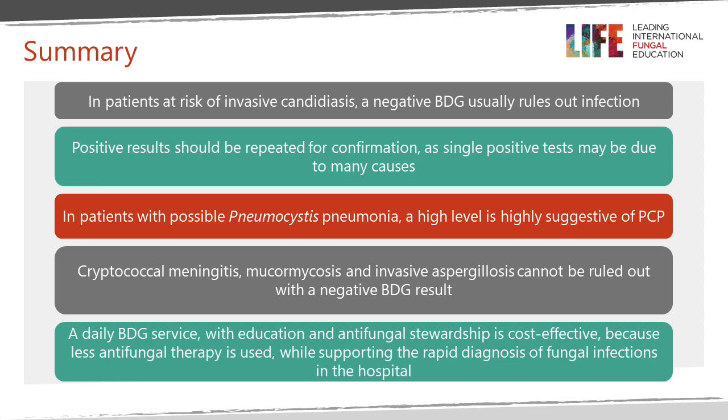So in conclusion, in patients at risk of invasive candidiasis, a negative BDG usually rules out infection. Positive results should be repeated for confirmation, as single positive results may be due to many causes, particularly in post-surgical patients and complex ICU patients. In patients with possible pneumocystis pneumonia, a high level is very suggestive of pneumocystis pneumonia.